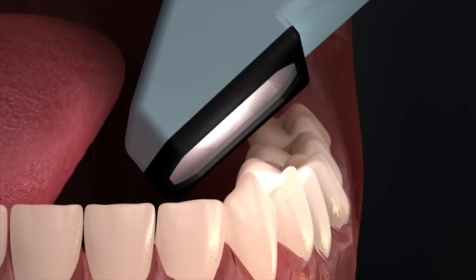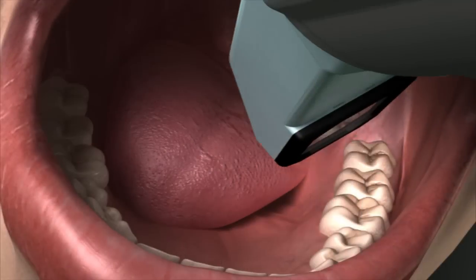There are several distinct changes when you move to the lingual side of the quadrant. The wand should be held at a 45 degree angle to the gingival margin and occlusal surface of the tooth. Starting again with the most distal molar, you will angle the wand so the cord is facing up at a 45 degree angle and the left edge of the scanning surface is placed directly against the tooth.